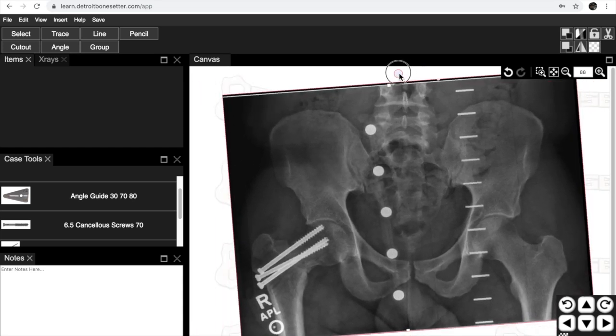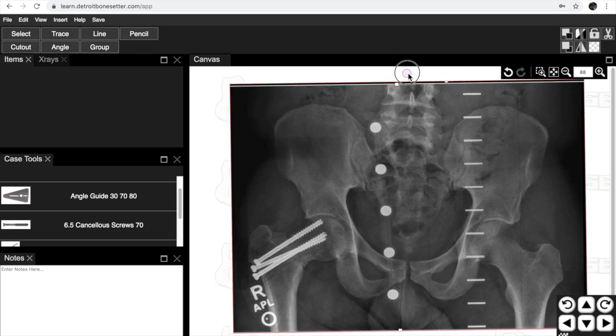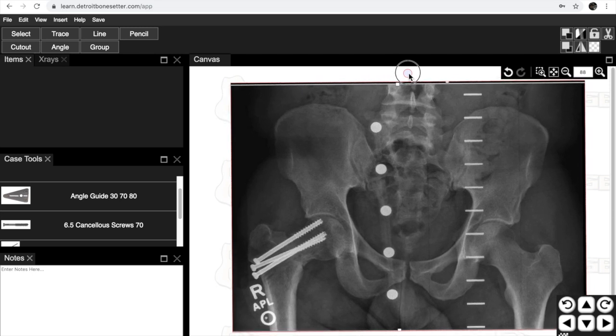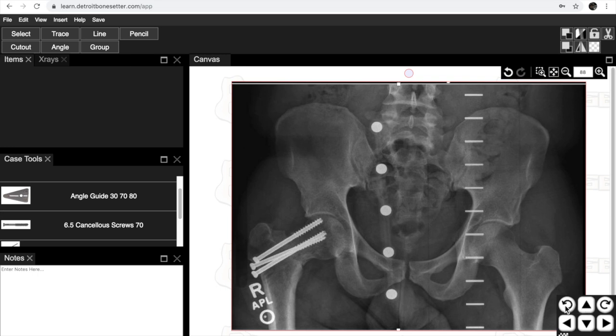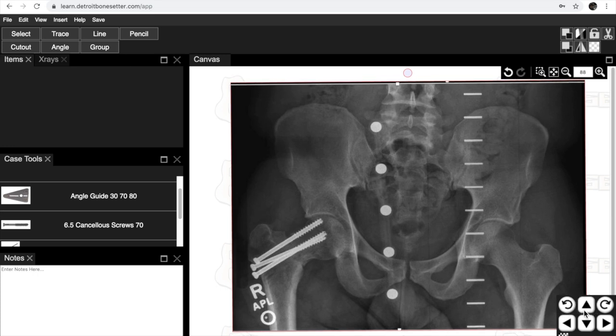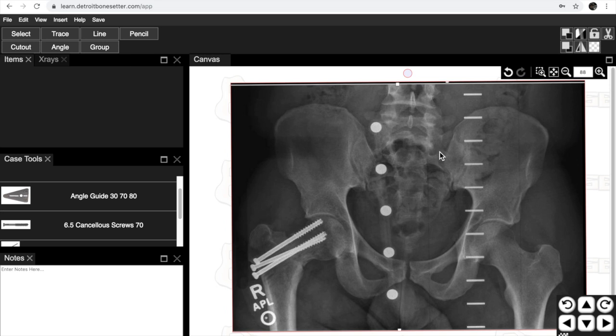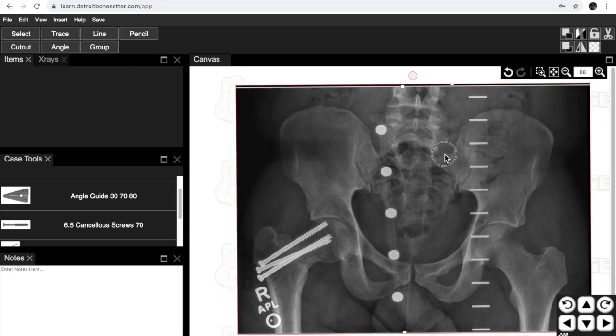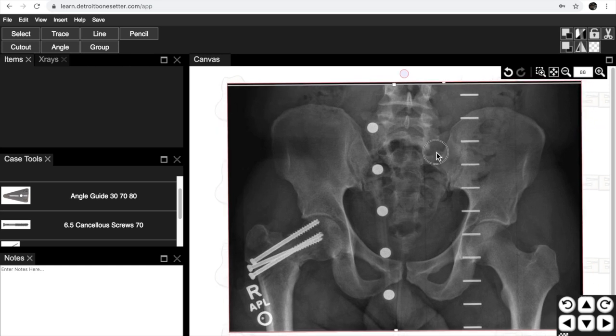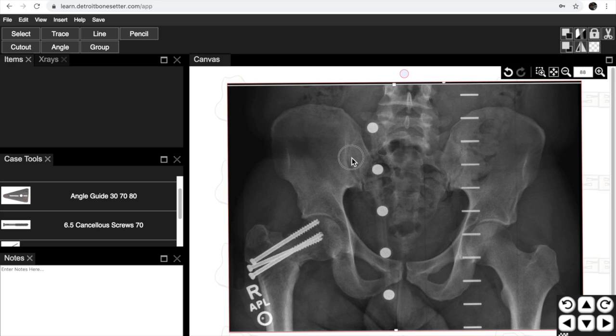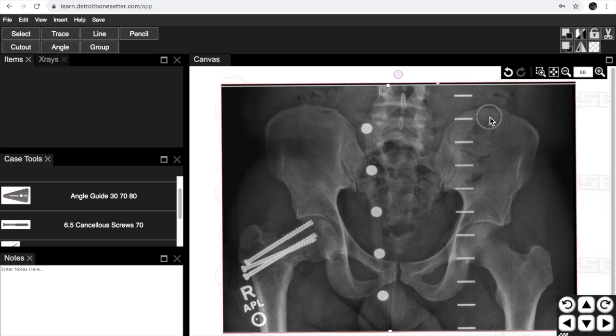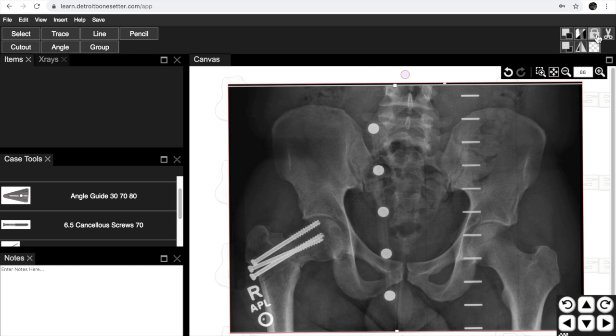You can see this little ball on the top. Every item when you click on it gets a ball. You can rotate it with that. Fine movements can be done down here with these small movement buttons. You can lock an x-ray or a tool by coming up here and pushing the lock tool. Now this won't move. You can unlock it and now it'll move.